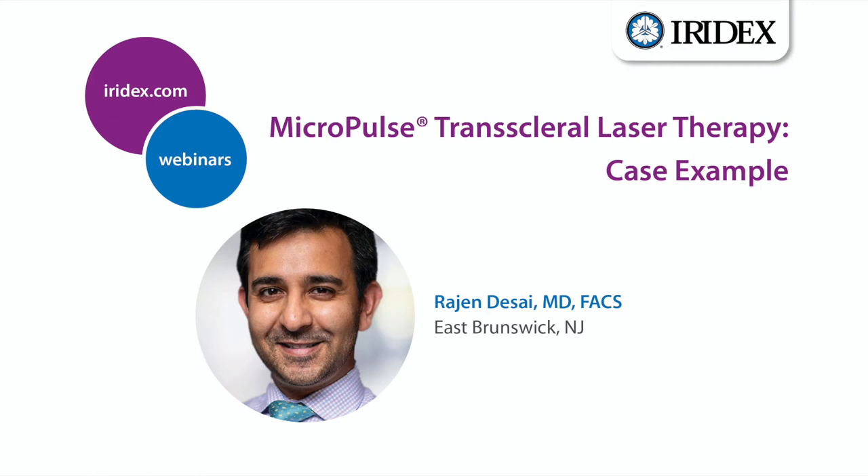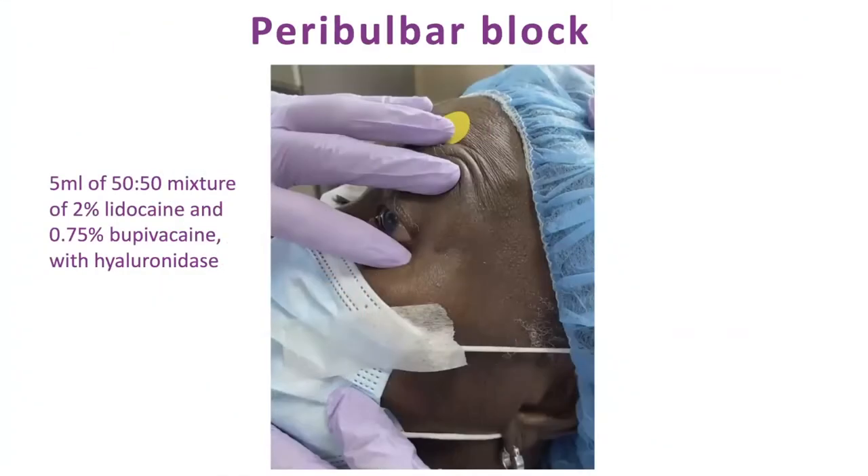Let me show you what I did on Monday so you can see the technique. The first step is to use a block — there are many options. We're lucky at our surgery center: the anesthesiologists do the blocks for us. They do a peribulbar block, which works phenomenally. So don't be scared of always needing a retrobulbar block.